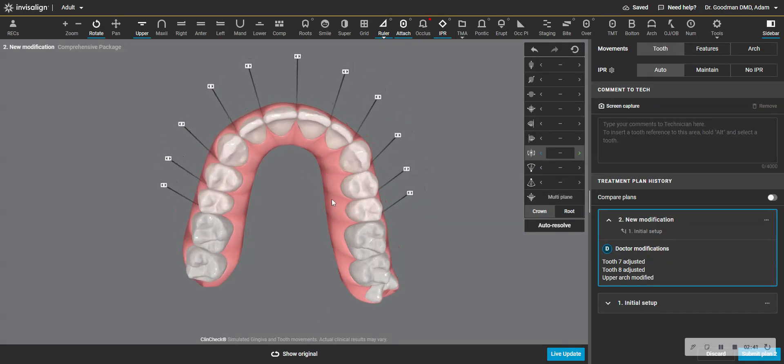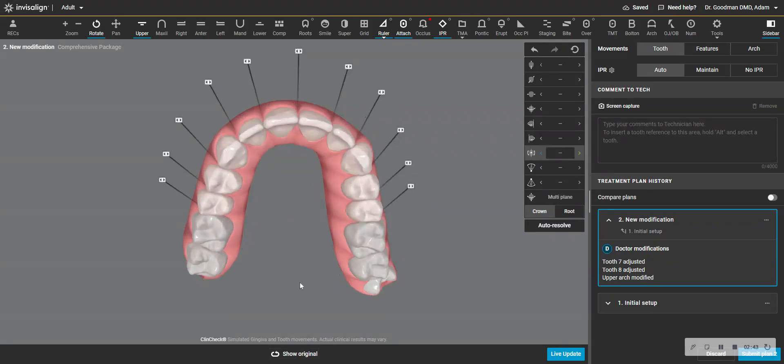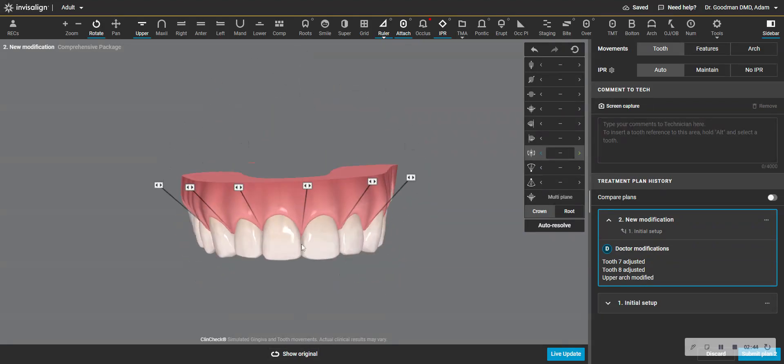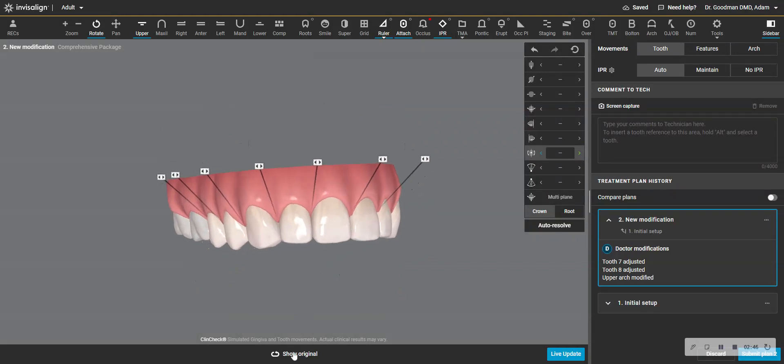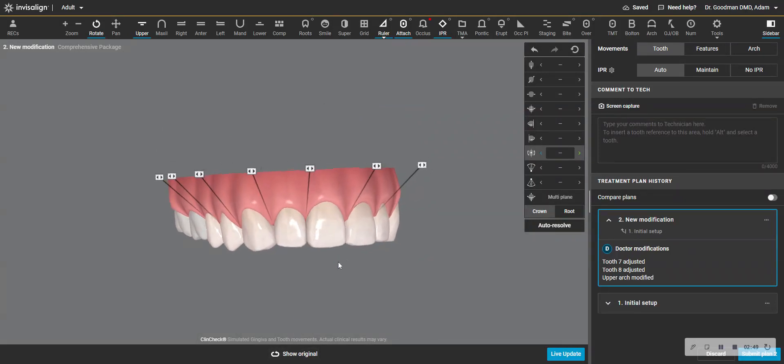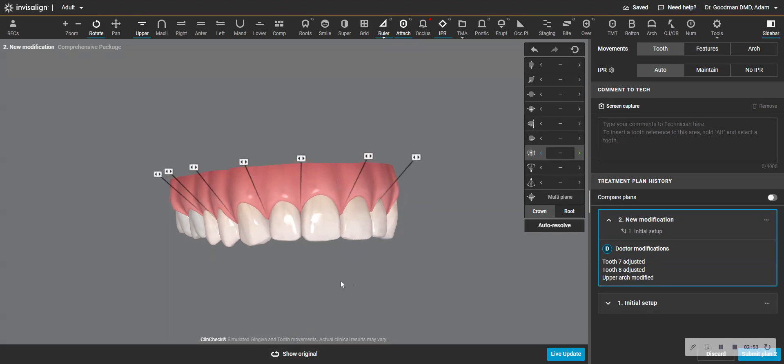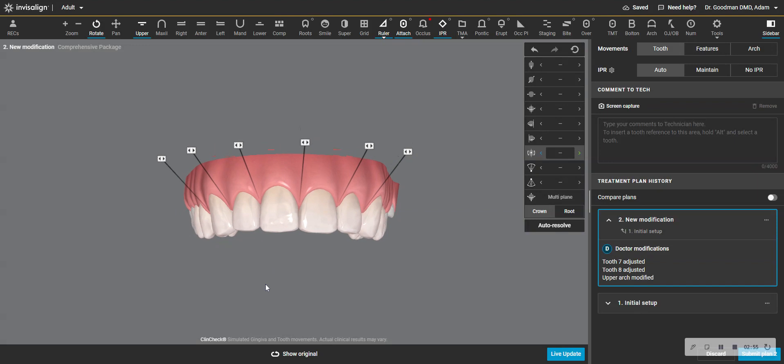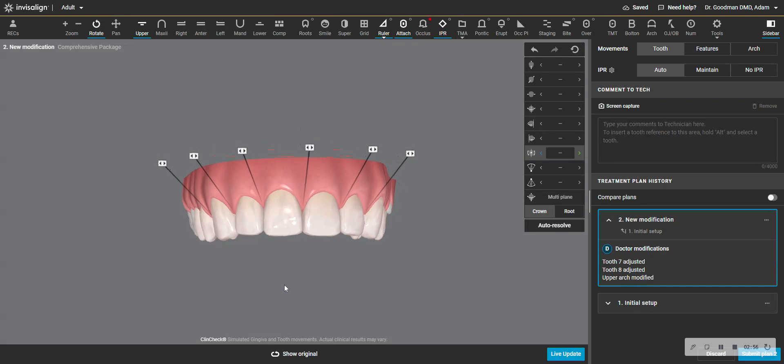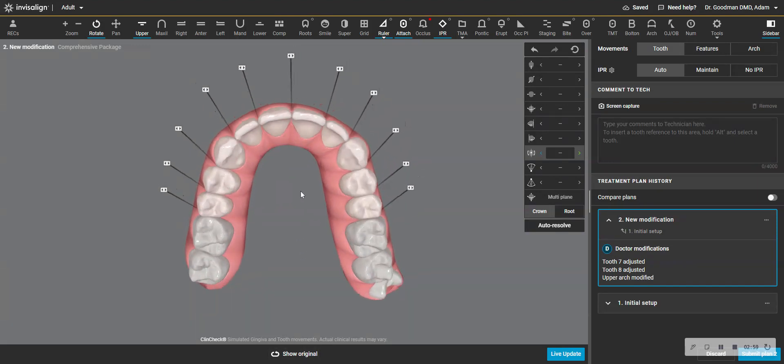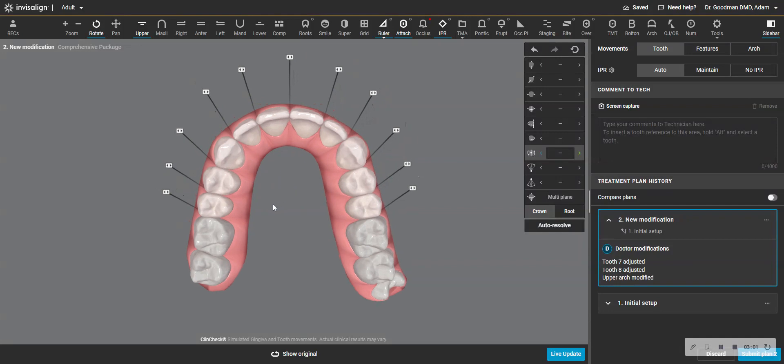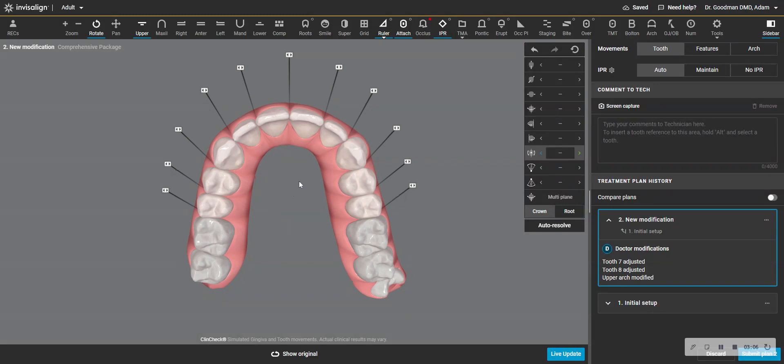So now I check out the movement that we want is still happening. But I've removed an innocent movement that is not critical to the case that is going to help my tooth stay inside the aligner without the need for any attachment and with a fine result. This is not compromising on the quality of the result to make these kinds of changes in this kind of situation for this particular case or cases of this order. Sometimes the root movement is required, but not here.